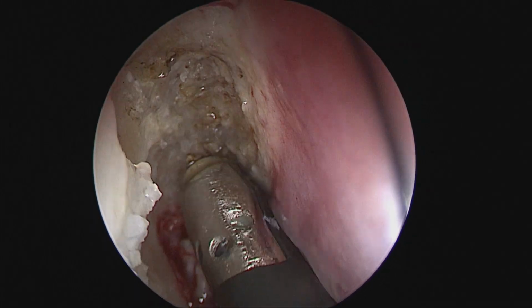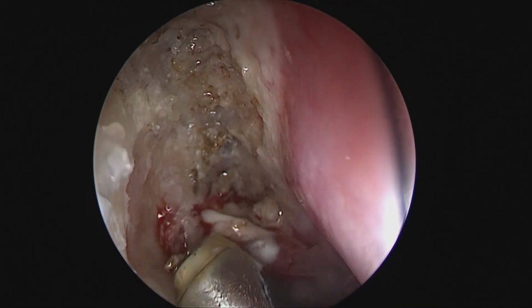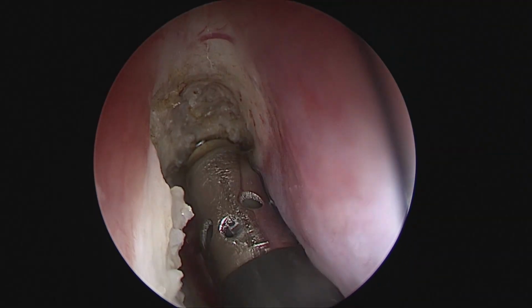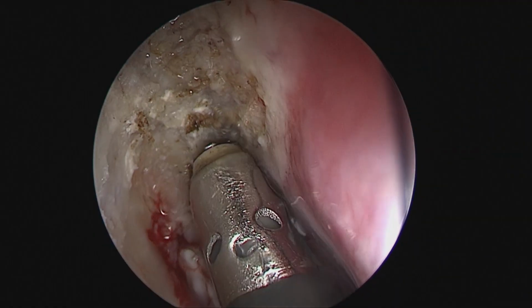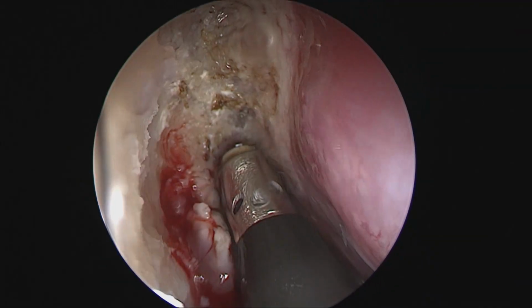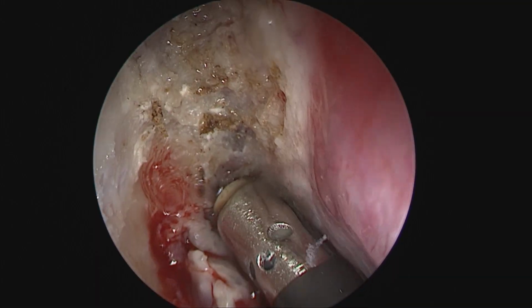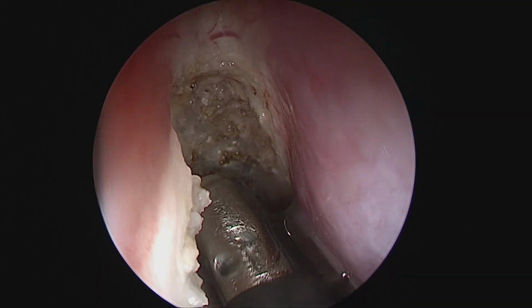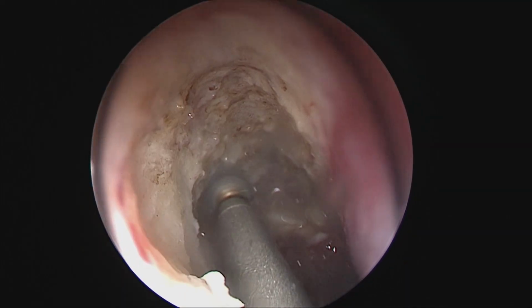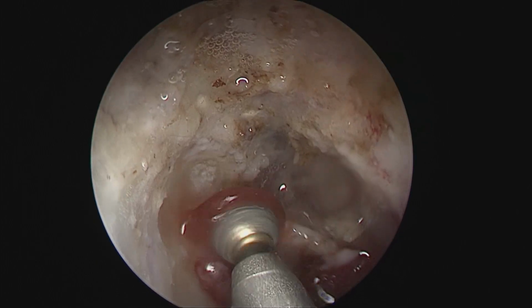and to keep drilling it so that, in a centripetal way, we come around the actual neoplastic lesion. A concern here is that in case there is any gross dysplasia in this lesion, or maybe a carcinoma in situ kind of situation, we could be sure that we have done an oncologic resection and not just picking tumor on multiple sides and engaging in random drilling.